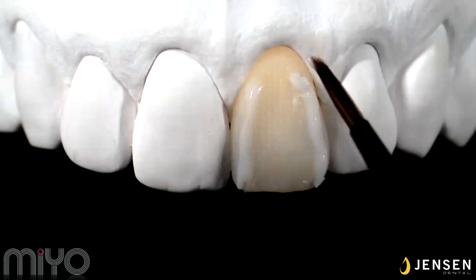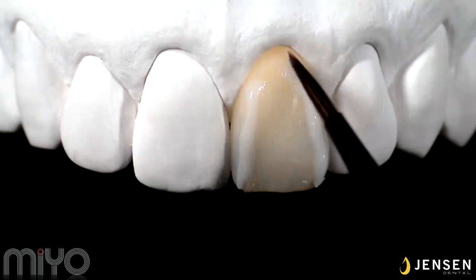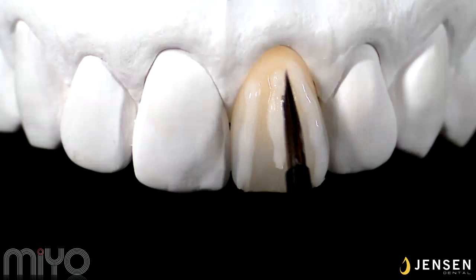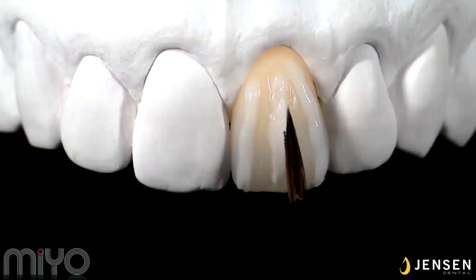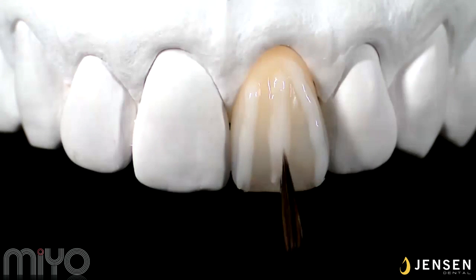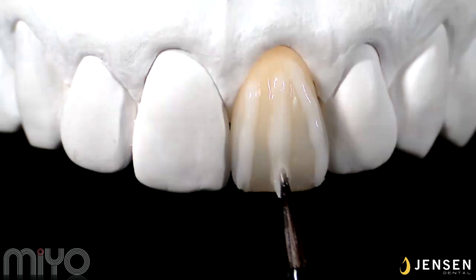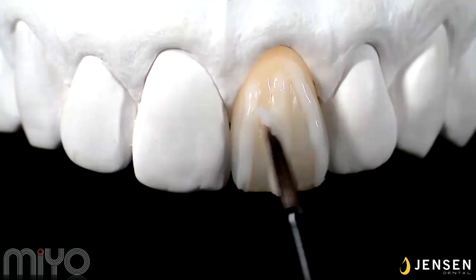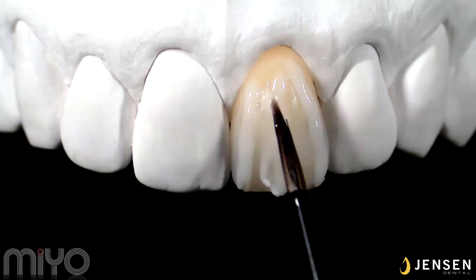Apply structure starting with the mesial and the distal lobes, and then the middle. Spread them evenly. Try to create the same thickness on the whole labial surface and create your final form with your brush here. Spend some time here since there is no need for grinding after it's fired. Structure material will glaze with every bake.